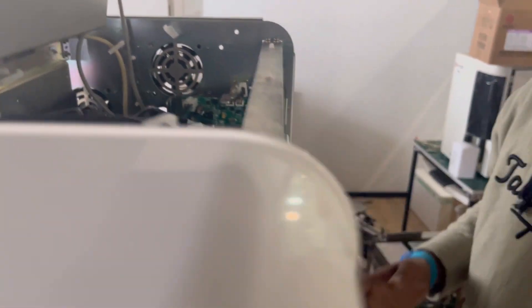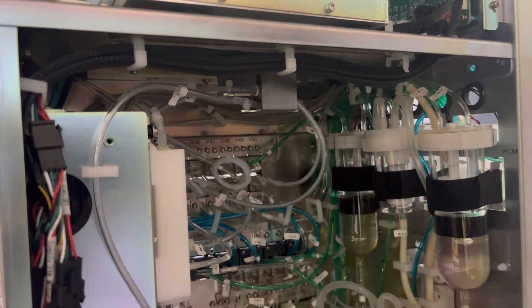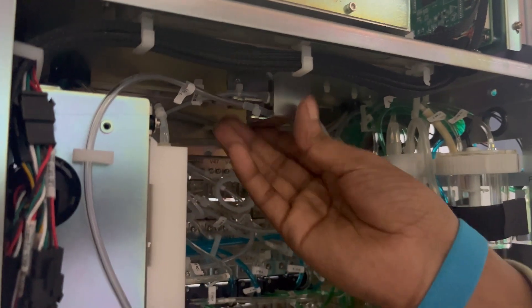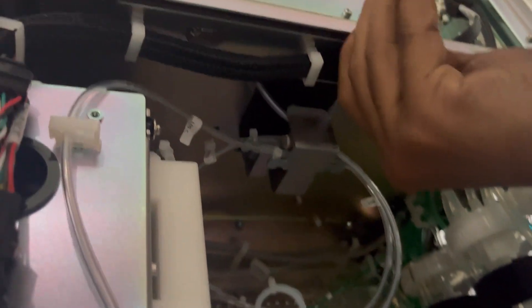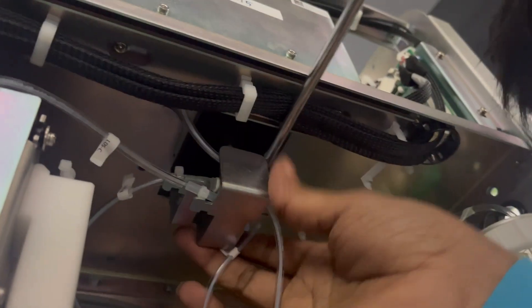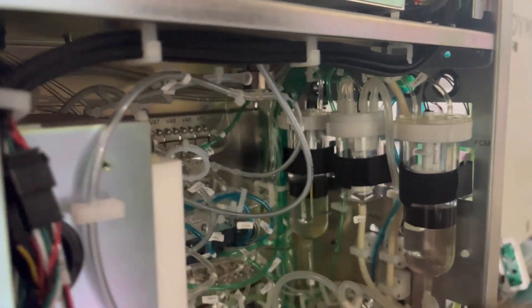Now we will disconnect the tube. As you can see, below the optical unit there is a tube. There is also a steel cover to protect the tube, so we first need to remove this cover. There are two screws — remove them.